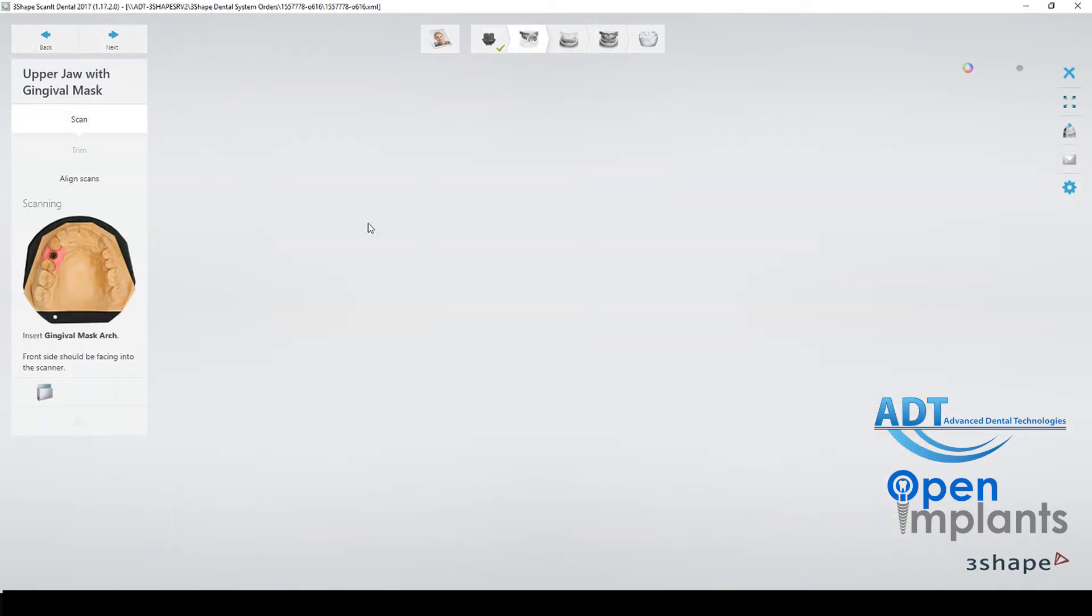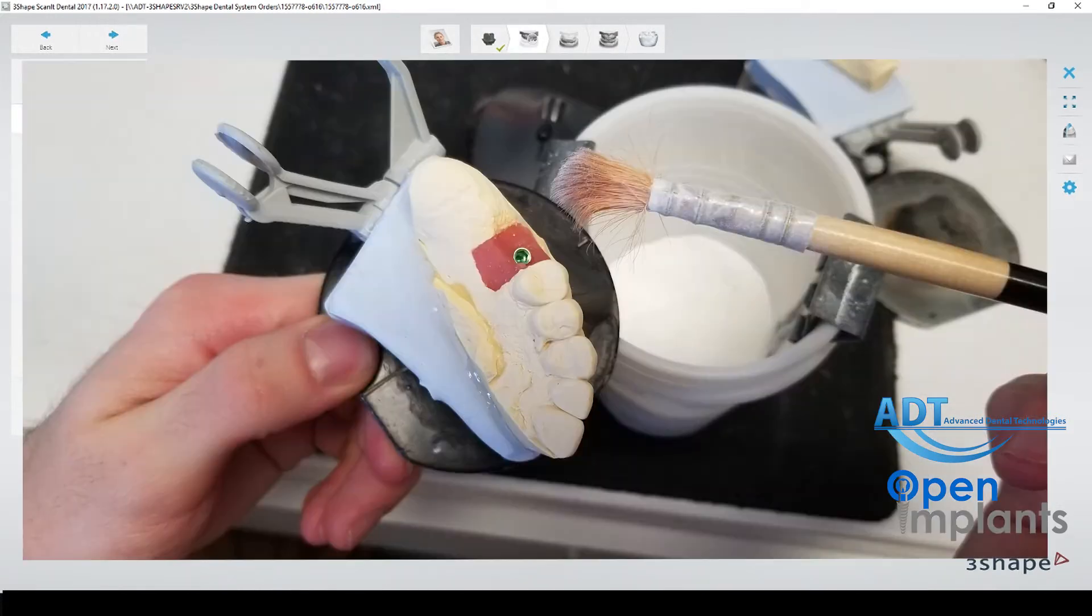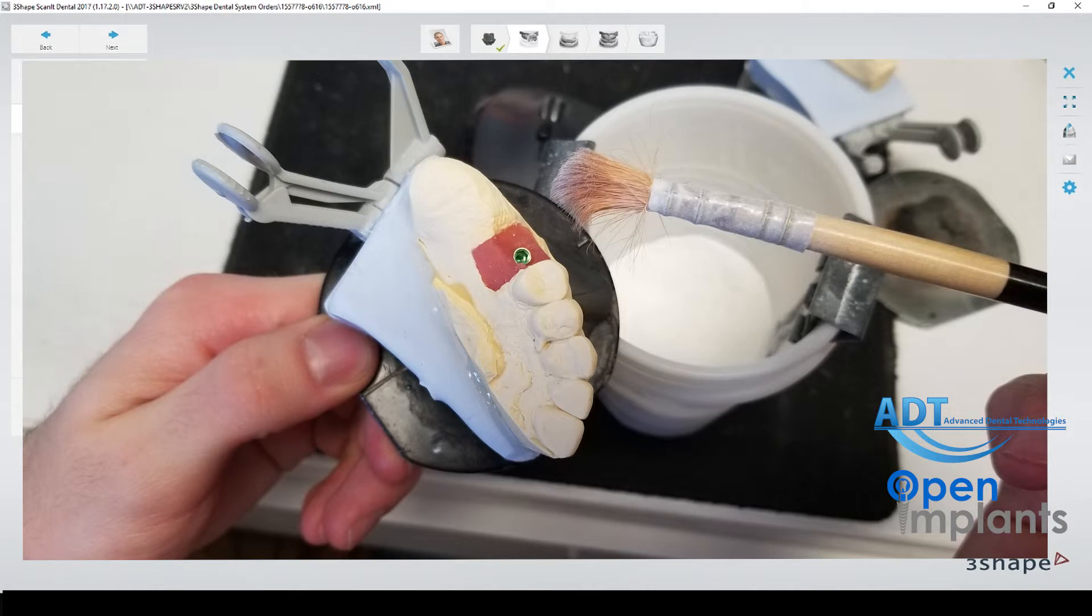Now we are scanning the gingival mask. We removed the scan body and for this we do need to use powder for the mask.